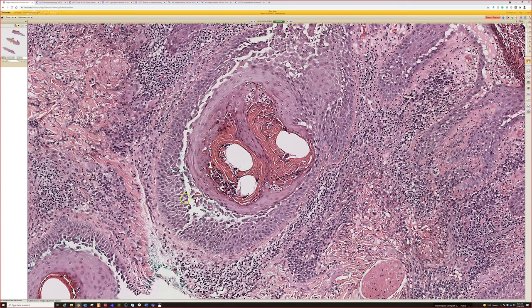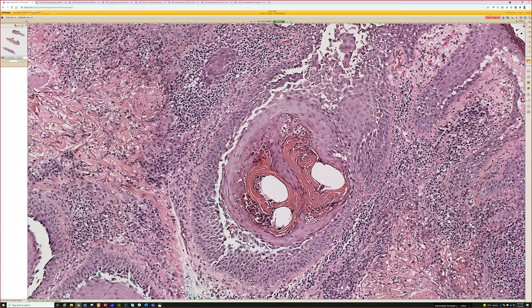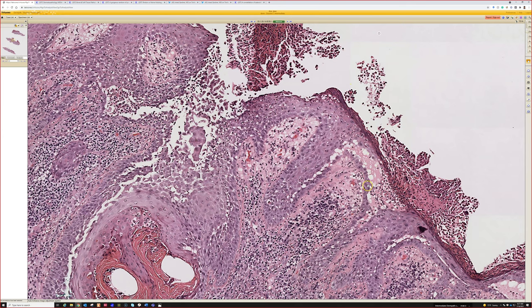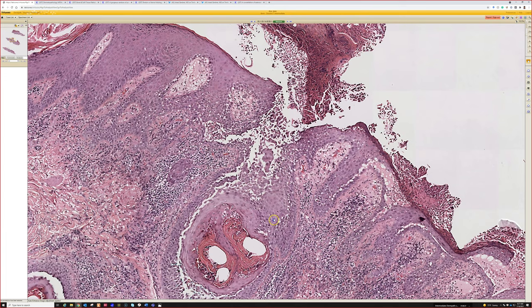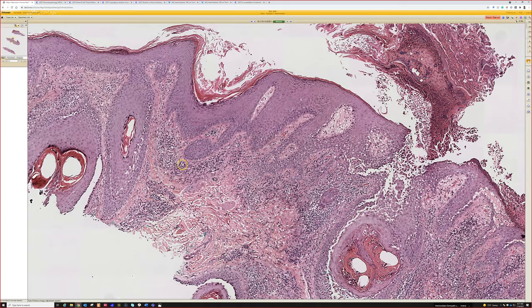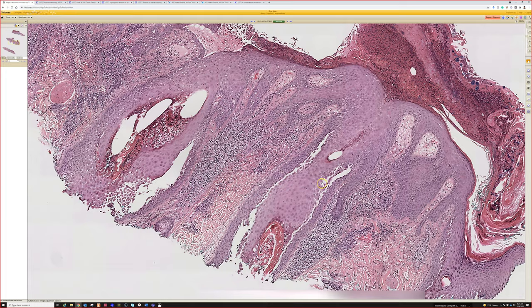Acantholysis with the basal layer intact and hair follicles involved — Pemphigus vulgaris. In real life practice it's sometimes harder to tell Pemphigus vulgaris versus Pemphigus foliaceus just on path. Usually we teach that in foliaceus the split is higher and in vulgaris it's lower. The same thing with the immunodeposits — the net-like IgG and C3 around keratinocytes. But in practice it's not always totally clear cut. I've had cases signed out as Pemphigus family that need to be further worked up clinically. Often clinically they're distinguished by the fact that vulgaris has oral involvement and foliaceus doesn't. A very good example of dramatic acantholysis down the follicle, and often you have lots of dermal inflammation associated with Pemphigus vulgaris.